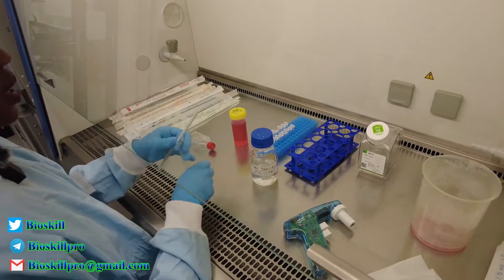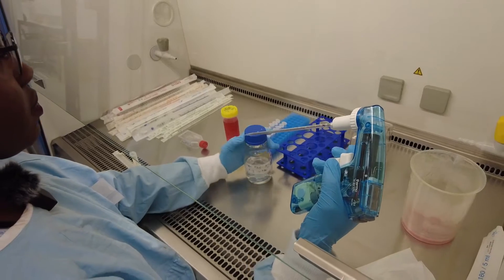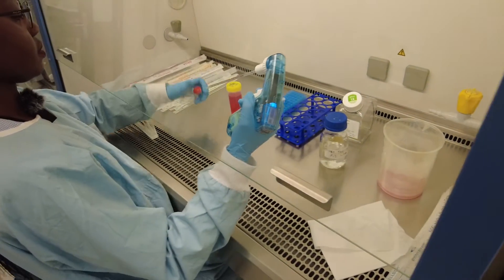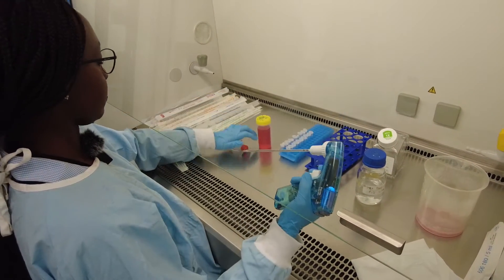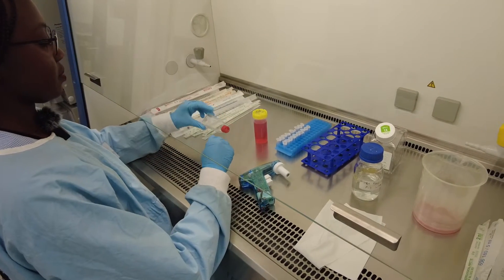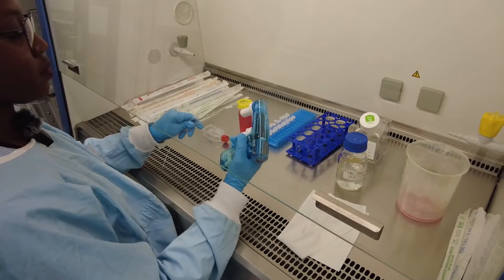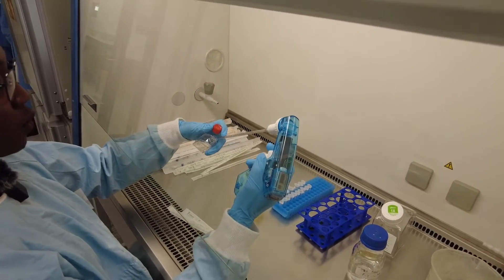We give it a quick rinse with PBS. We're going to add about 2 ml, shake it around, and give it a good rinse. Then we remove the PBS after washing the cells.